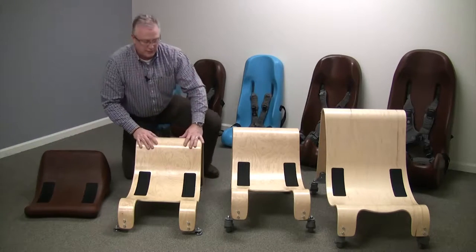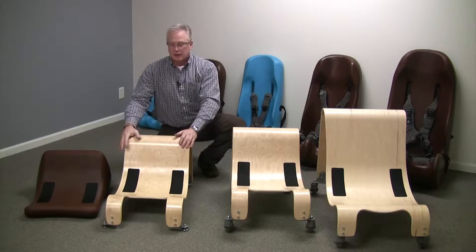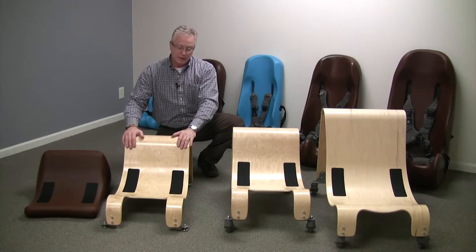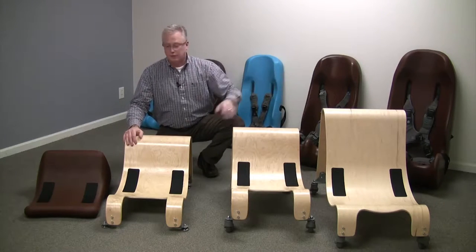Moving on to the next bases, we have our stationary base, which is available in the small and the large. The small, which you see right here, fits sizes one through three of the soft touch sitters, and the large fits the size four and five.